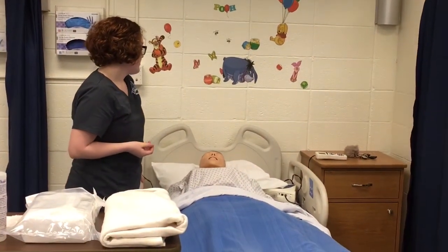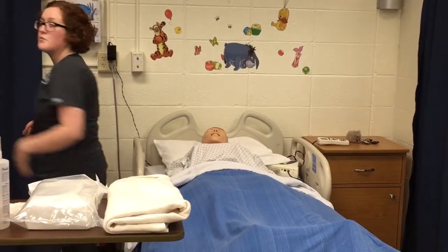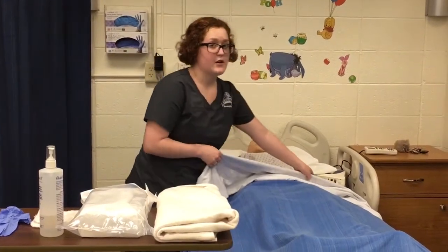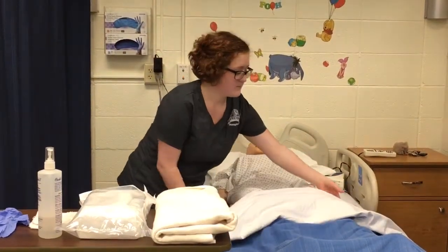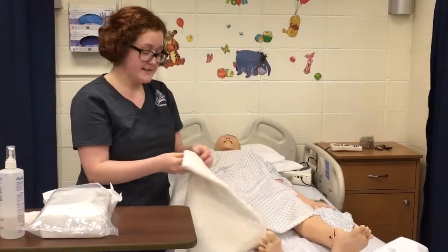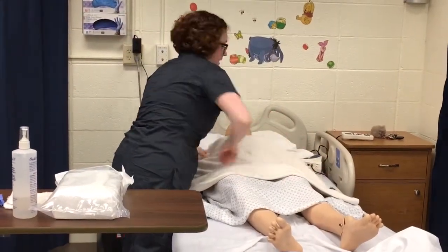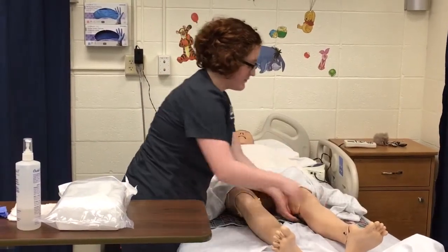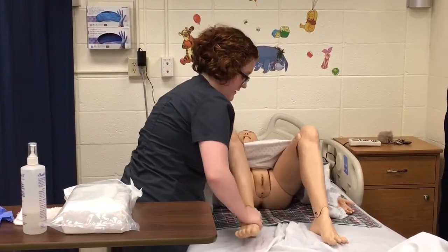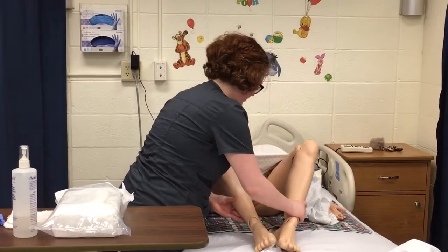After I have explained the procedure to them, I'm going to provide privacy and perform hand hygiene. Then I'm going to get ready to perform perineal care. I'm going to pull this blanket back and cover her up with a bath blanket instead, just to keep her comfortable. My patient is going to remain in the supine position, and I'm going to elevate her feet, have her feet placed on the bed, and let her knees just fall out.